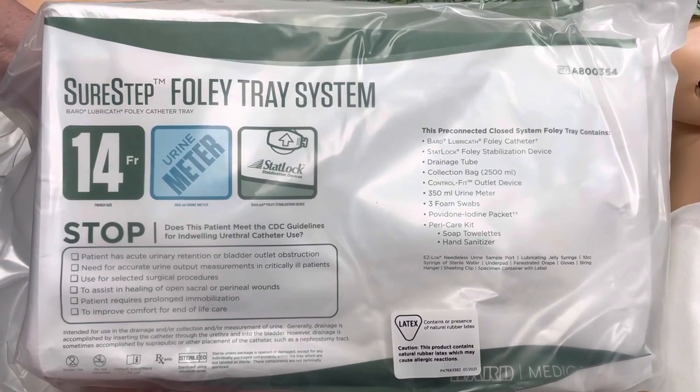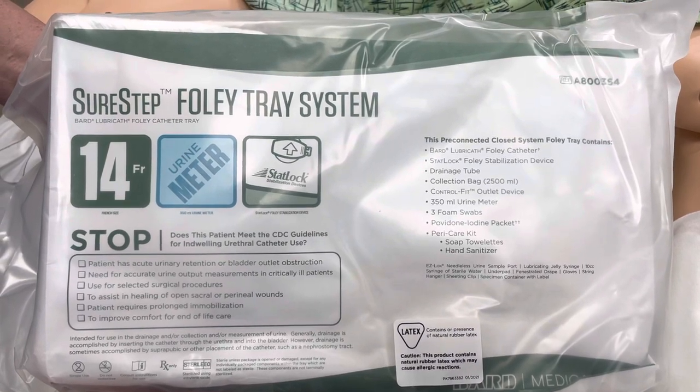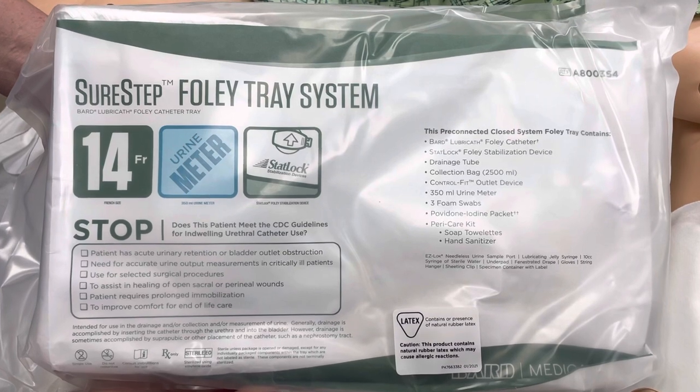Hi, this is your clinical education team and today we're coming to you to talk about insertion of an indwelling Foley catheter, the correct way to apply it, early removal, and how to protect our patient through correct maintenance.